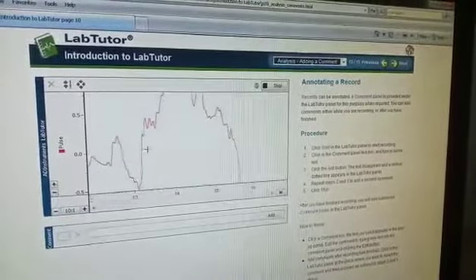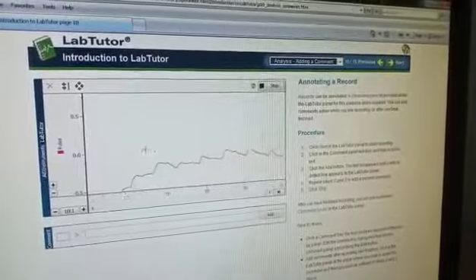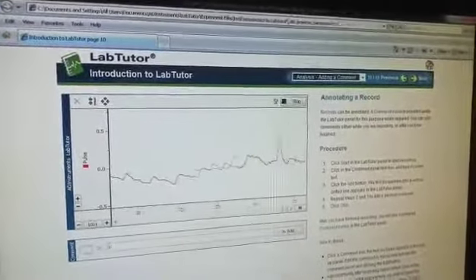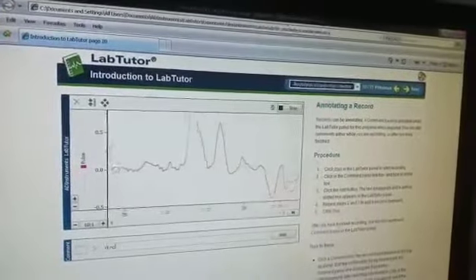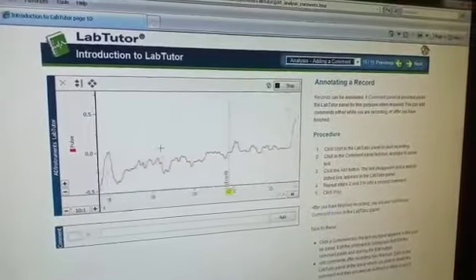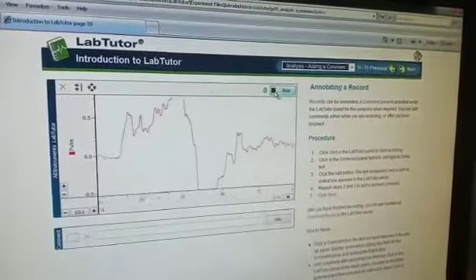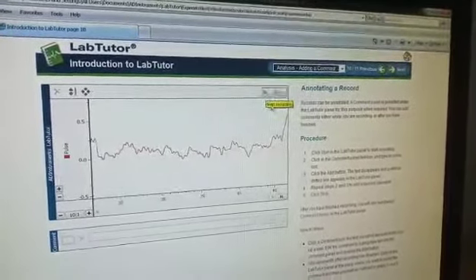Now let's see, this is the recording of roll number 98. So you can add comments like this. Okay, and after obtaining the trace, just stop the recording. Okay, now moving to the next.